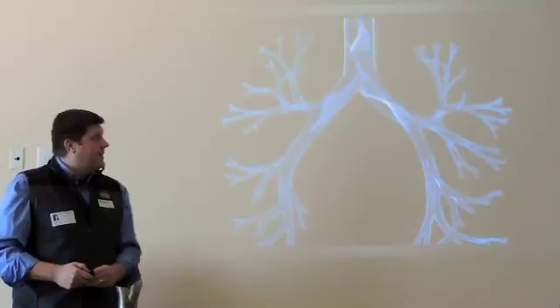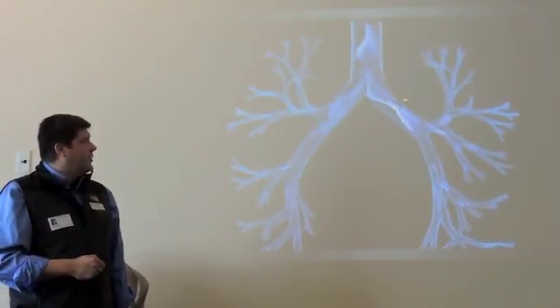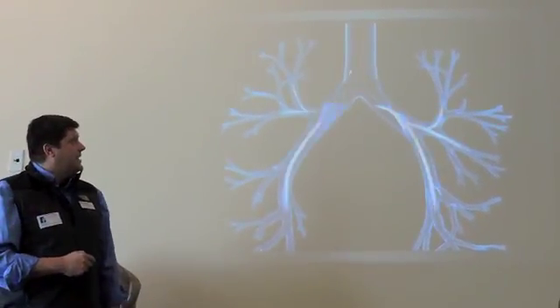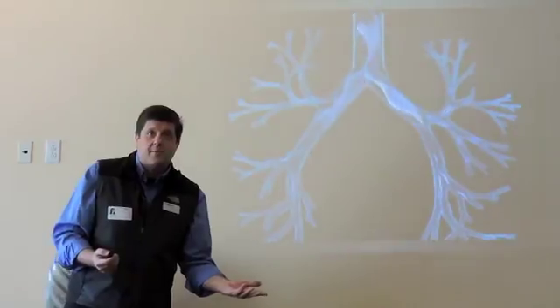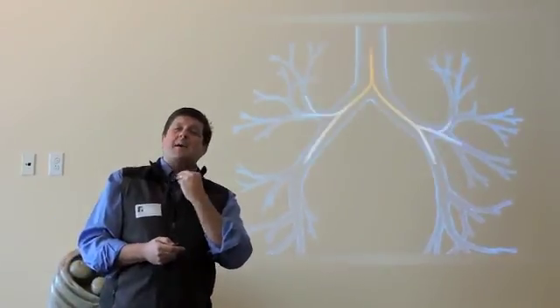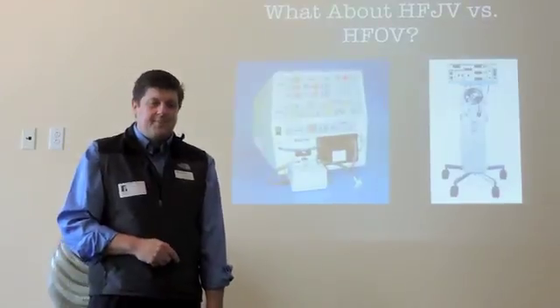Because this gas isn't exerting any pressure or volume on the airway walls, a lot of our most successful jet patients have been TE fistulas and BP fistulas, where the jet gas literally shoots right past the hole and doesn't aggravate it at all. That's a study that's been replicated, where I think they took some cats. Sorry if you like cats, but I think they cut out holes in their trachea and measured absolutely no volume loss whatsoever when using the jet.